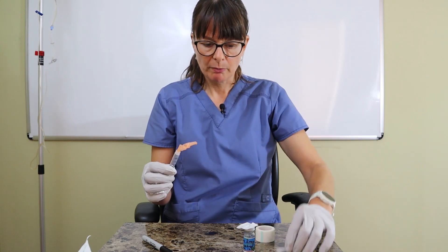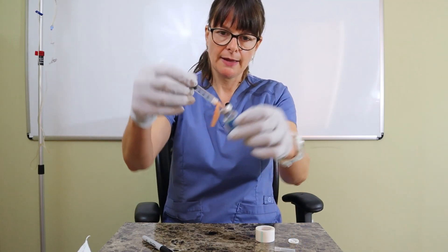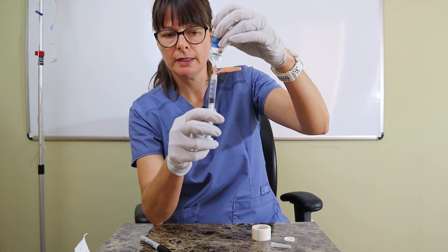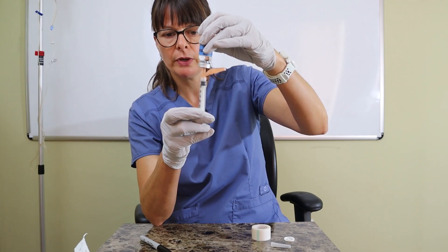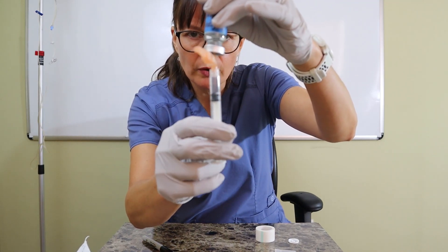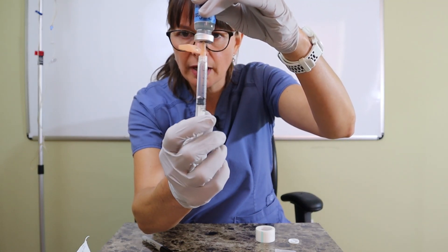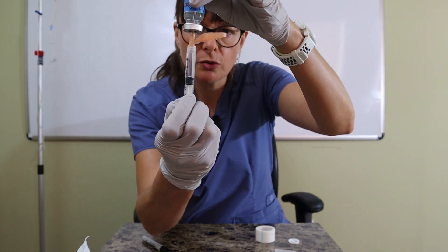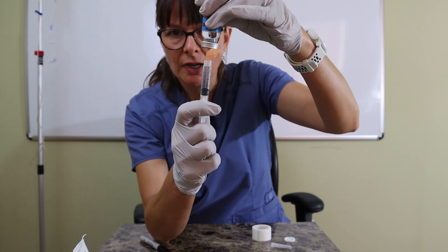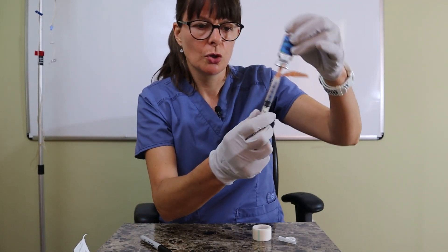I uncap my needle, put the needle into the rubber stopper, and then it's best to put it all the way in and turn it upside down. Move the needle back down to make sure the tip is sitting in the fluid — but don't touch the needle with anything. Push the air in, and as soon as I let go of the plunger, the medication draws in. You can see a little turbulent flow and some air bubbles. I can pull the plunger down and push the medication up and down to get rid of the bubbles, until the plunger is at 2 mls.